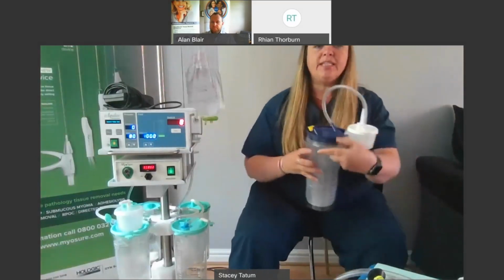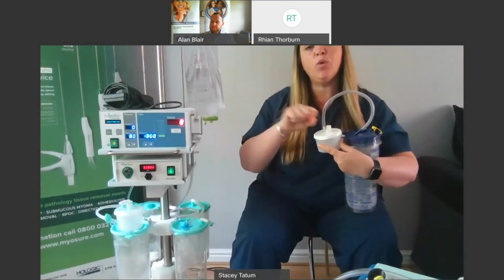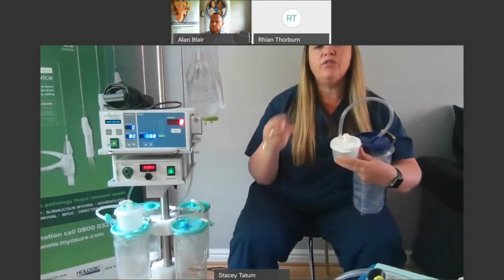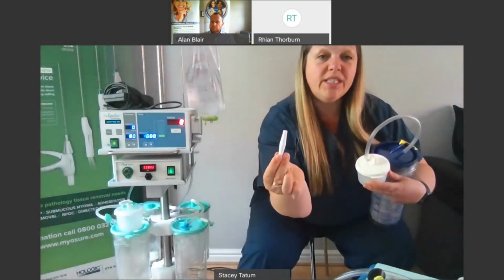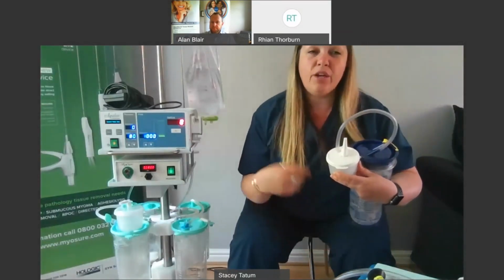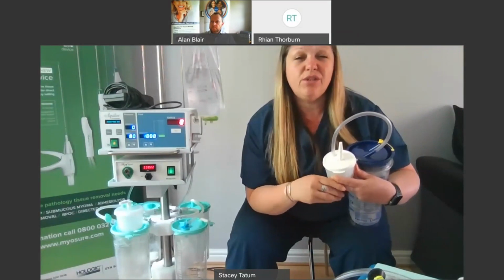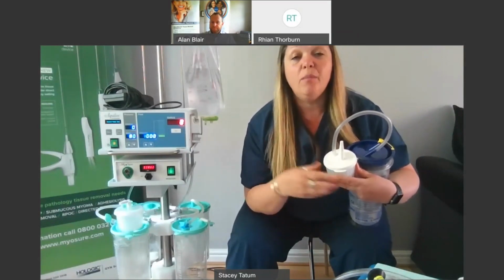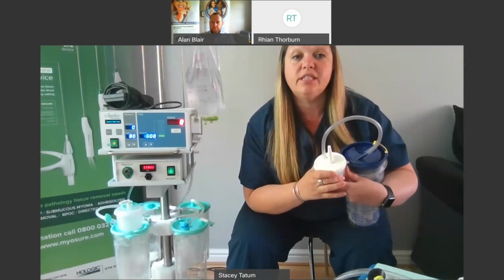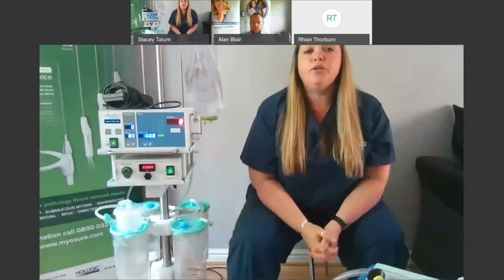You will also see on this blue canister that we have a VAC-SAG tissue trap. We've had feedback that sometimes it's quite difficult to get the end of the cutting device onto the tissue trap. So VAC-SAG now provide, I think you buy them in packets of 20, a little adapter that just goes into your tissue trap like that, and your device will go on top. You'll probably have something similar in your suction tubing, which you can use. So if you just save those, because I think you tend to chuck them away anyway, if you can just save them in a bag, put them with your MyoSure stuff, and that will just be easy for when you place the cutting device on there. And Alan's going to show you a little photo to show you how it should look.